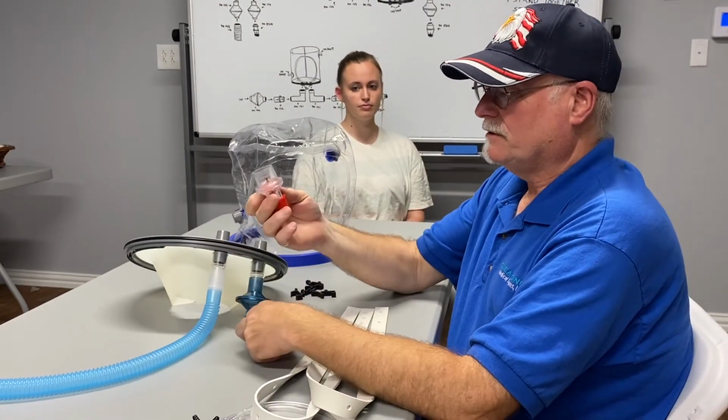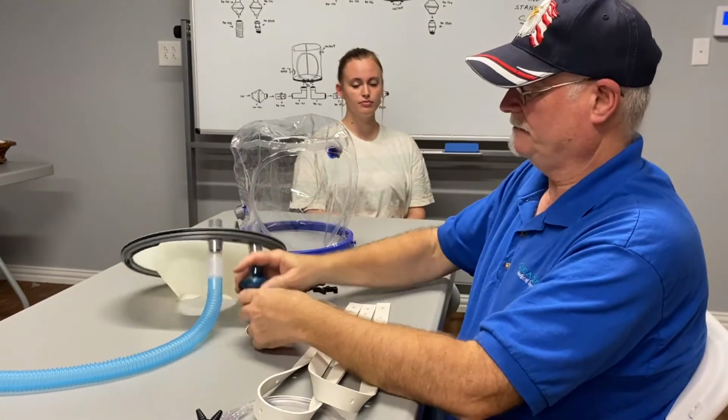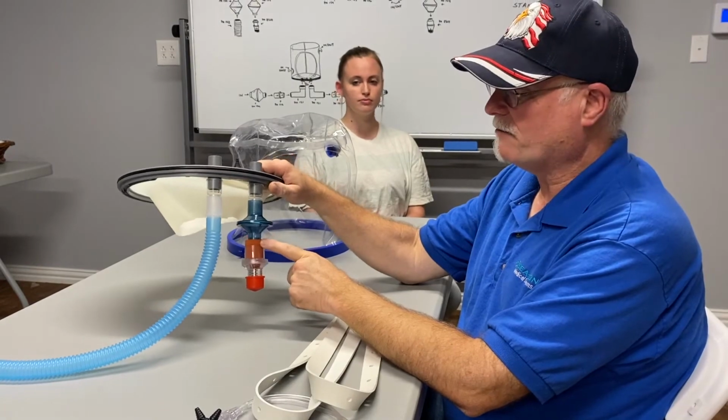You assemble the PEEP valve to its adapter. That has to be done first or it won't fit correctly. When you put it on, it swells up to give you a good positive seal.